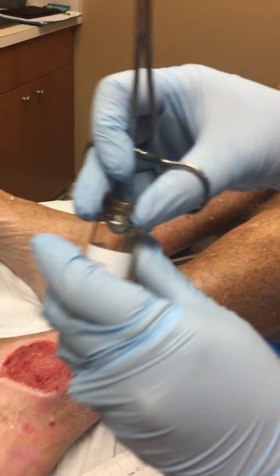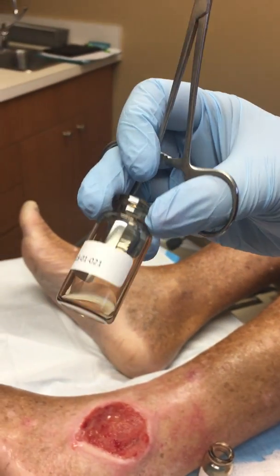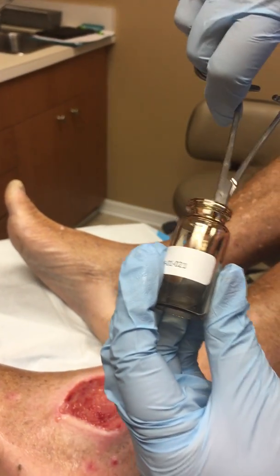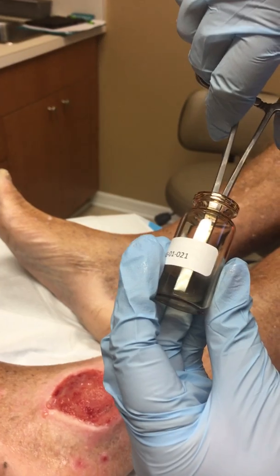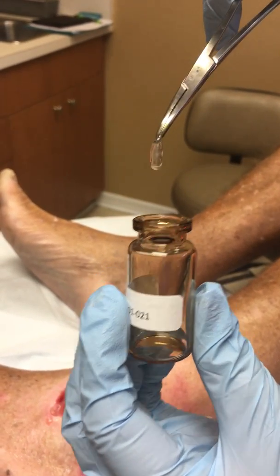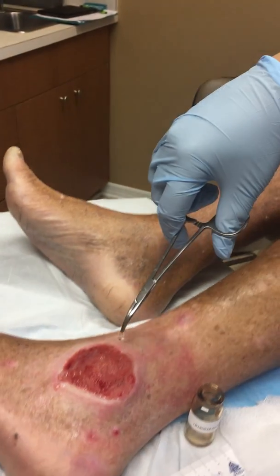The second piece — you can kind of see it in there. Here's the piece; it's a smaller piece.